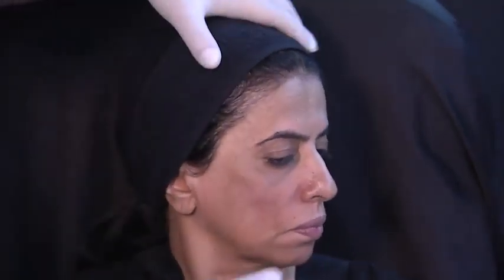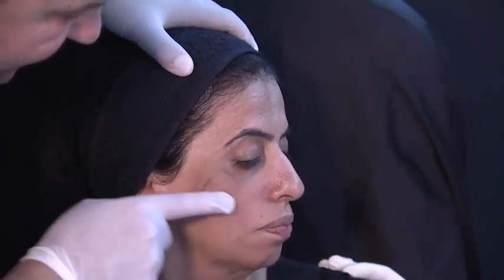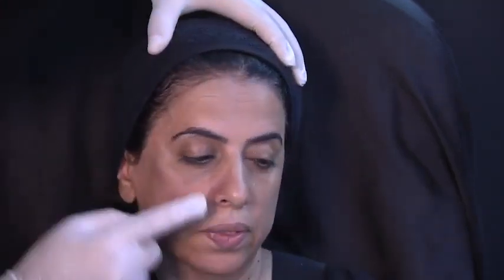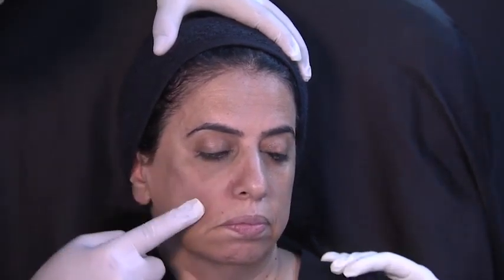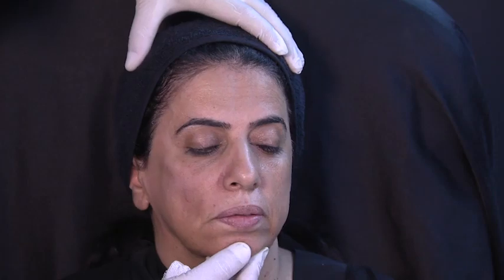Although we have a good improvement, we mold, we do have a good improvement here, but look at the camera, sit up. Now, I want also some more improvement. Look, after all this, she still has a little bit to improve in this area. If I go deep again with volume, I need another ml to see the final result that I want. So what I'm going to do is go more superficial.